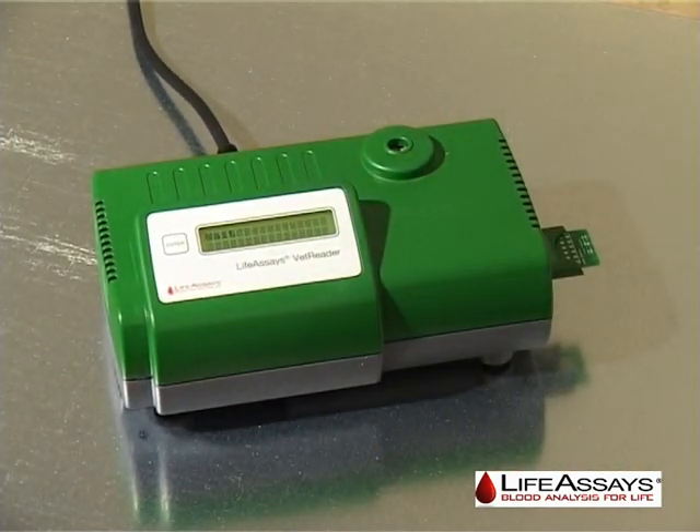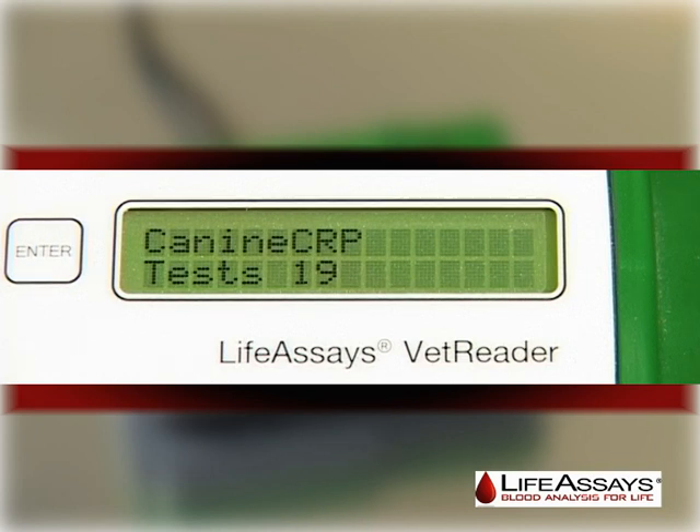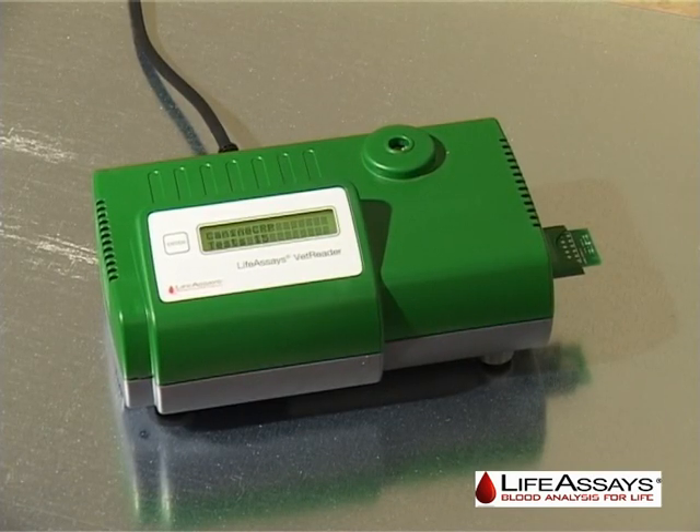Once the reagent vial is unloaded from the instrument, the display will show canine CRP test 19, where 19 indicates the number of tests left on the chip.